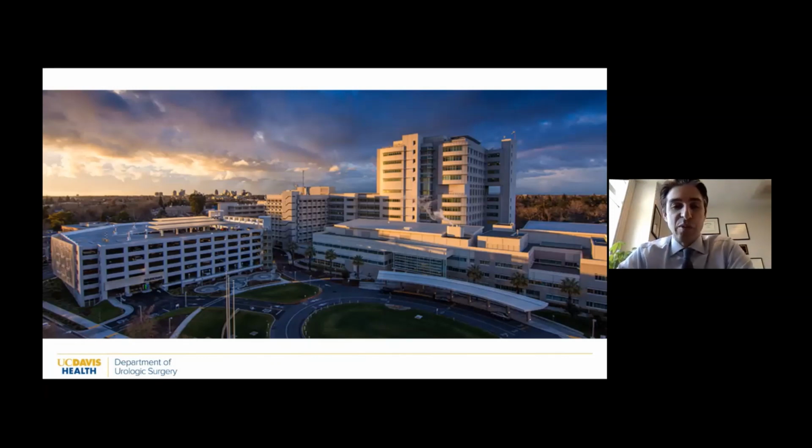The lithotripter that we use, it's a Storz F2. I think it even quotes up to 15 or 18 centimeters of depth. My personal experience, I haven't had that success at that point. So if you're talking about 15 centimeters skin to stone, I think there's going to just be a lower success rate. But that's, again, my personal experience with shockwave.